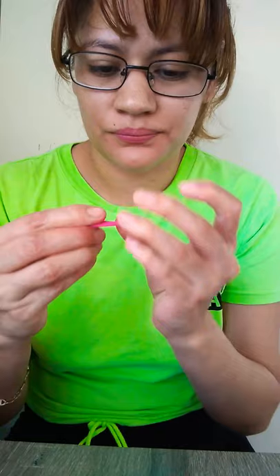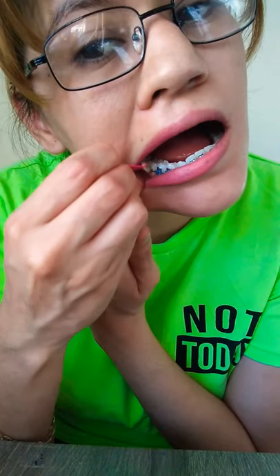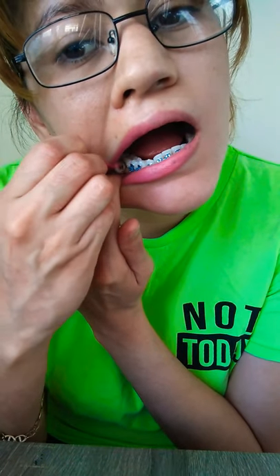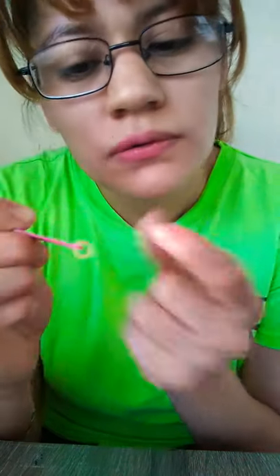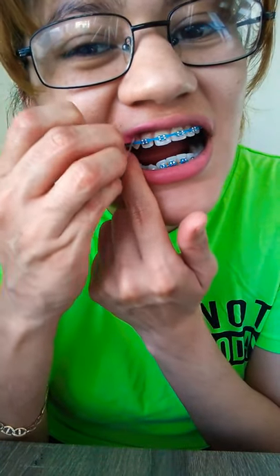It's a little bit trickier to see on the camera. I got lipstick all over me. And then the other side. And that's how you put them on.